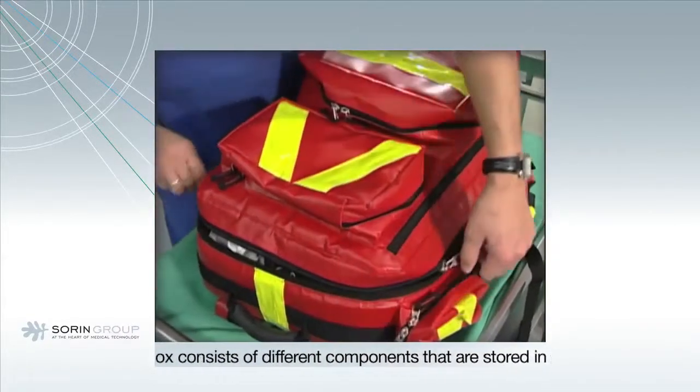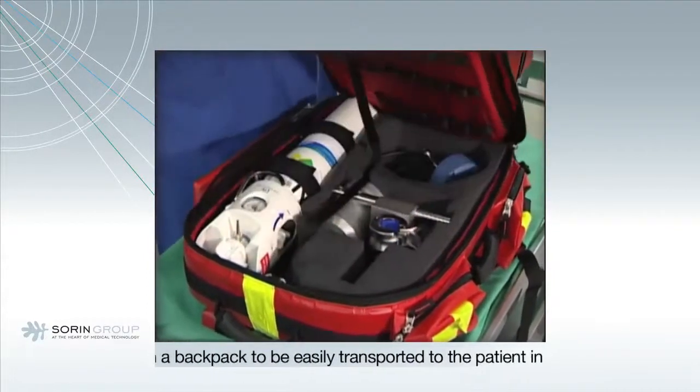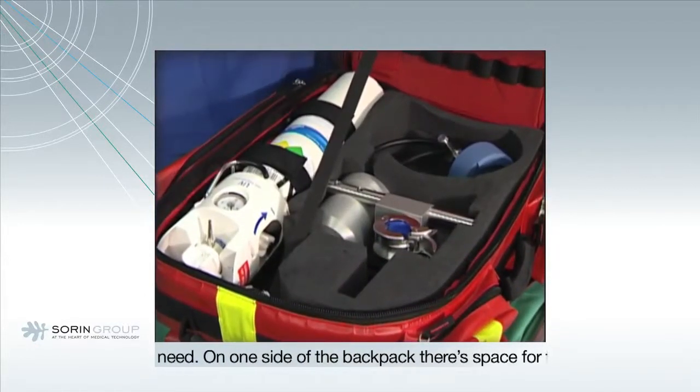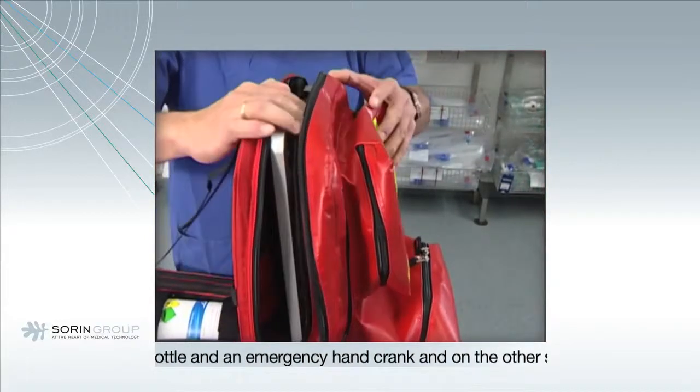To install LifeBox, open the backpack. On one side, there's space to transport the oxygen bottle and the emergency hand crank. On the other side, there's the bottom plate and the mast.